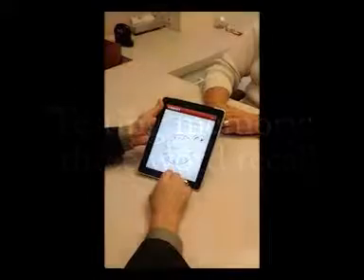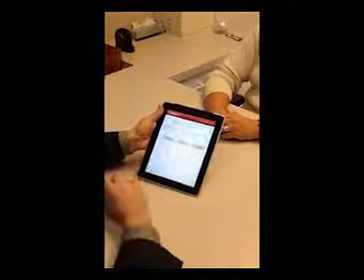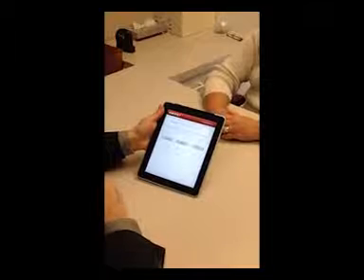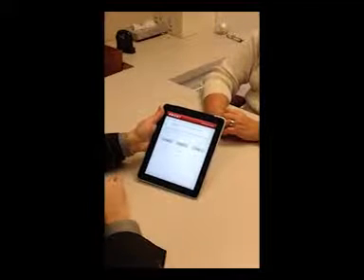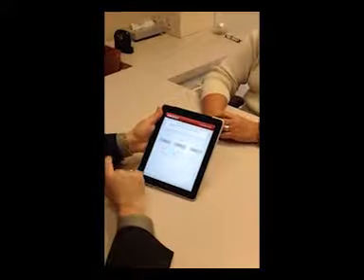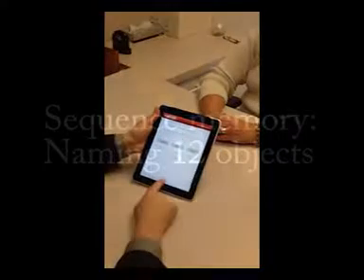After completing the clock, we're going to move to the next part of the test, which is the recall of those 3 words which we locked in before. So Julie, what were the 3 words I asked you to remember? Yellow, nickel, and you can't remember the 3rd one, so I'll mark that as wrong.